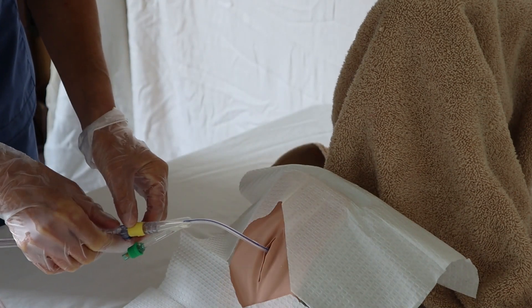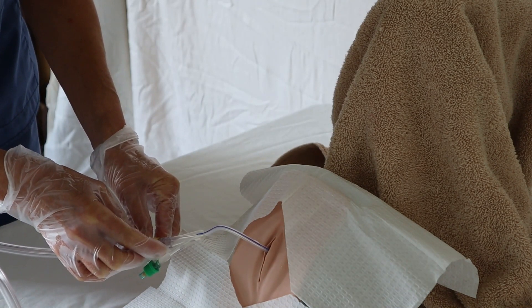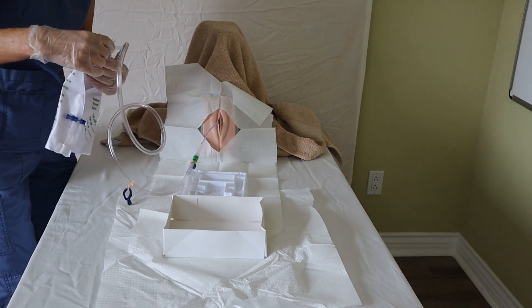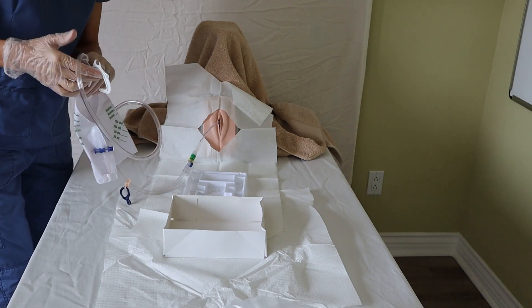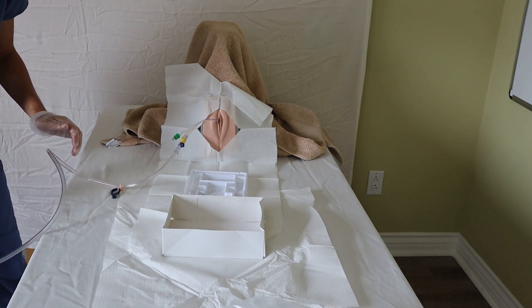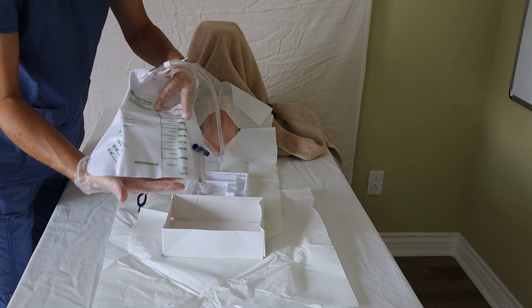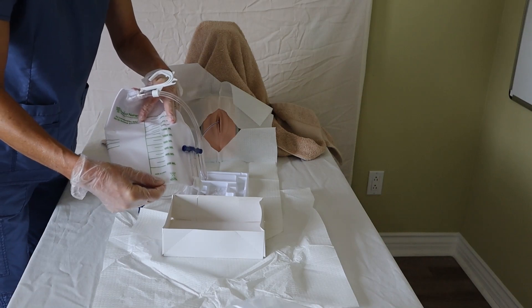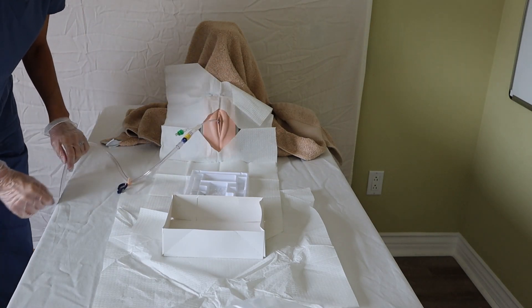Gently tug on the catheter until you feel resistance — that means the catheter is now at the bladder neck. Secure the catheter at the Y bifurcation to the patient's leg with the leg securement device. Take the bag and hook it to a non-movable part of the bed, and by gravity it will drain and fill up. Once it stops draining, I can measure the urine output, which is important to chart after inserting the catheter.